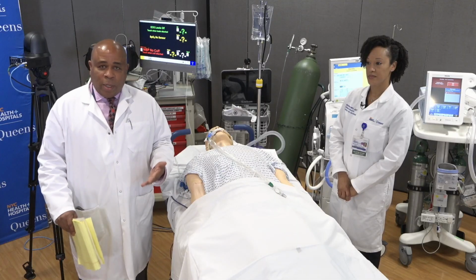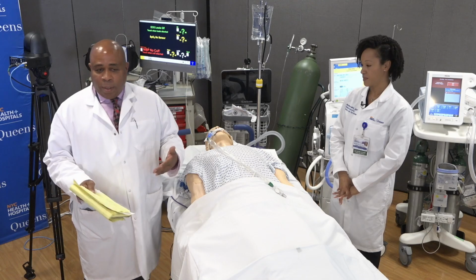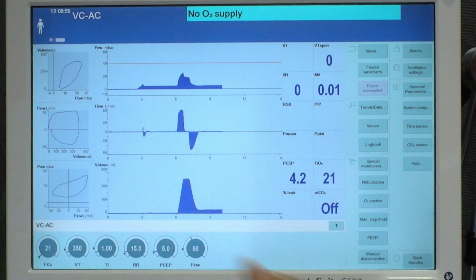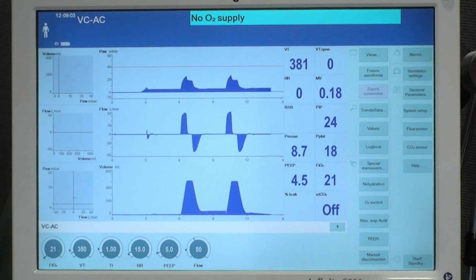The purpose of simulation is to practice in a safe space. So answers could be incorrect, correct, we don't care, because in the end of the day, we all learn from each other. On the ventilator itself, at the bottom, is where all the settings are placed.